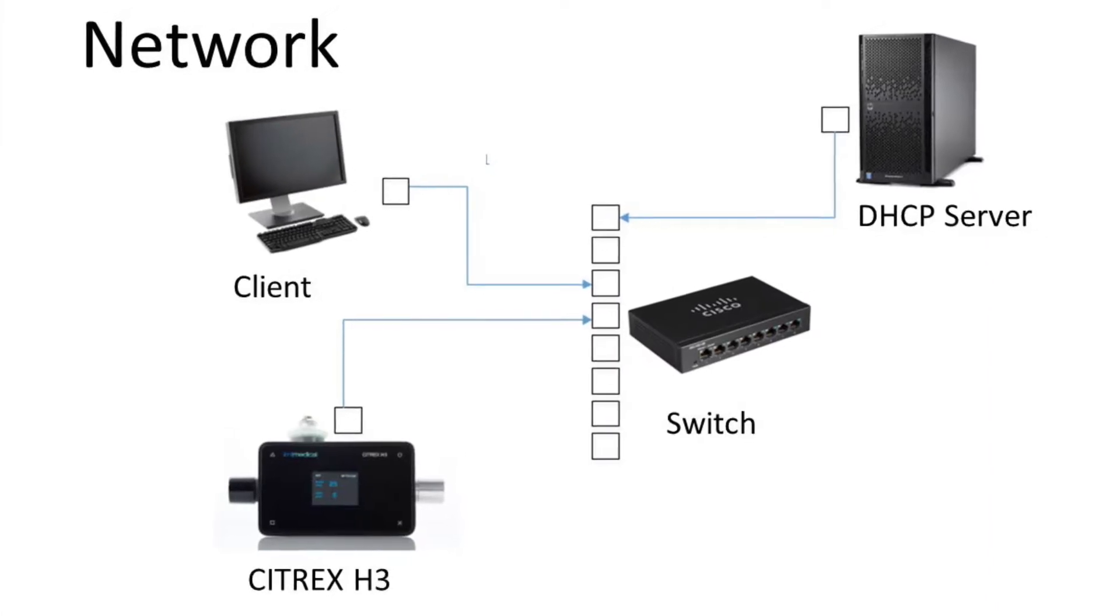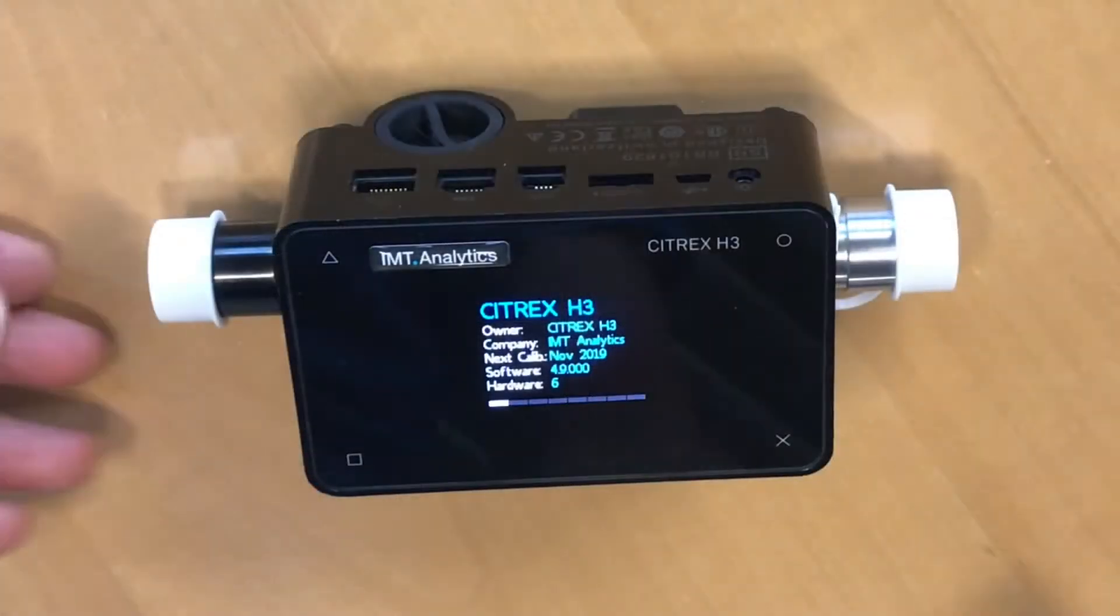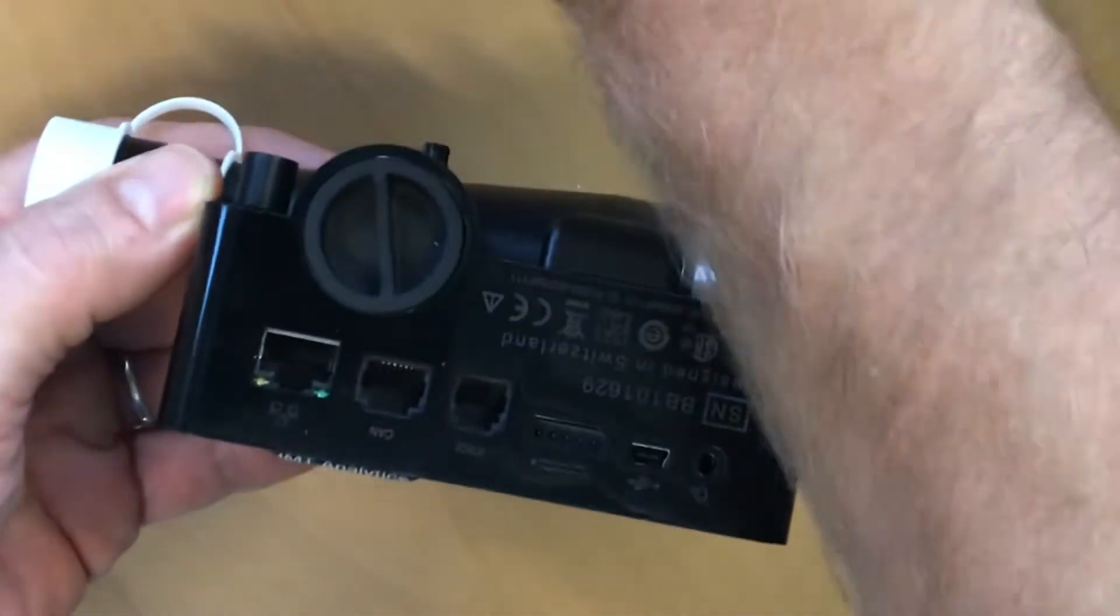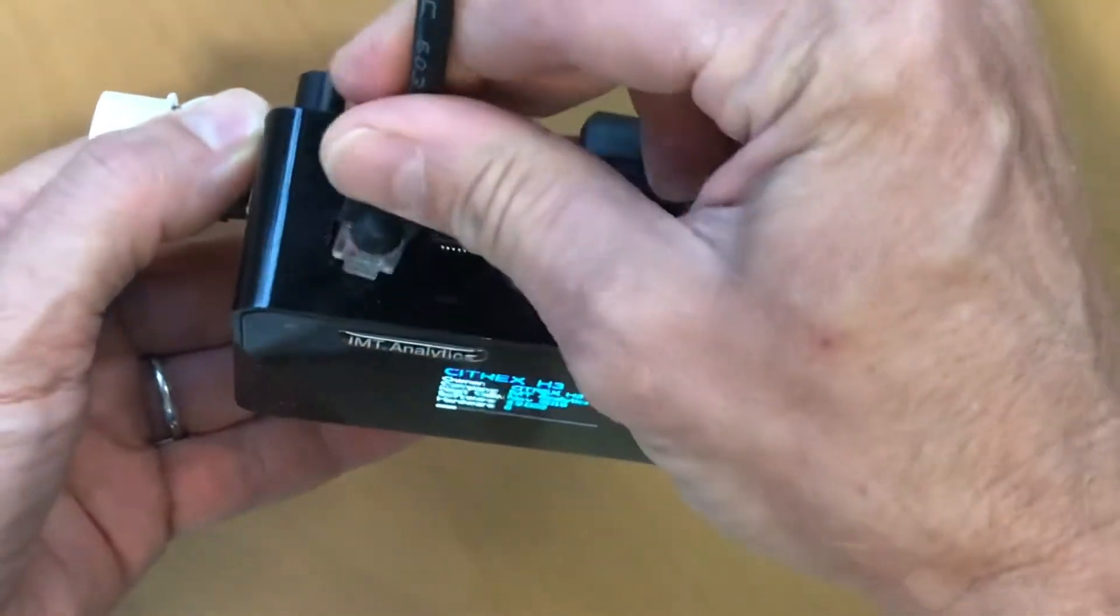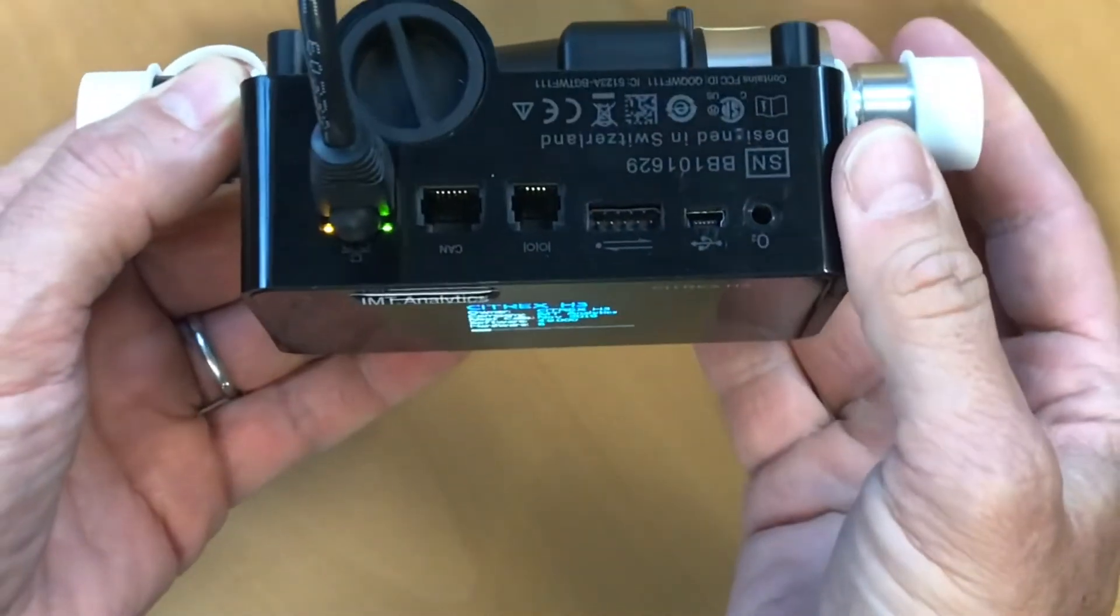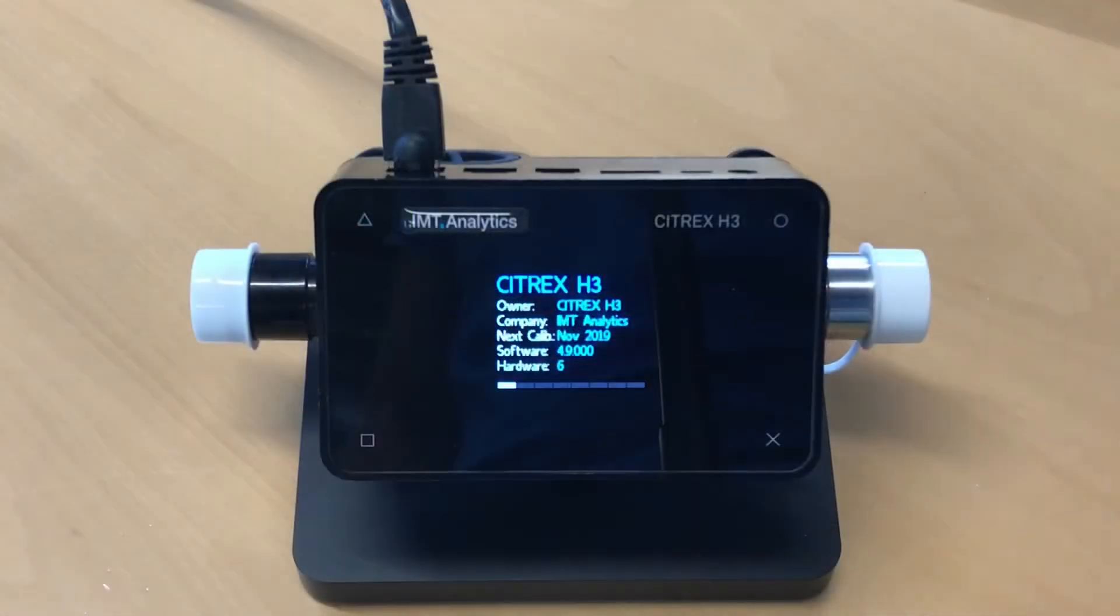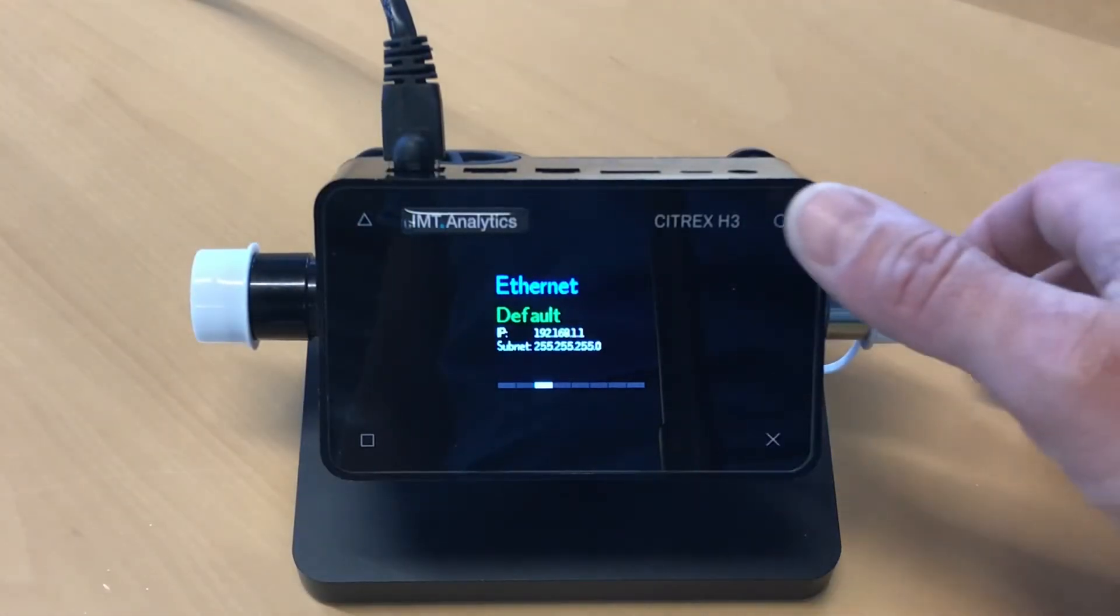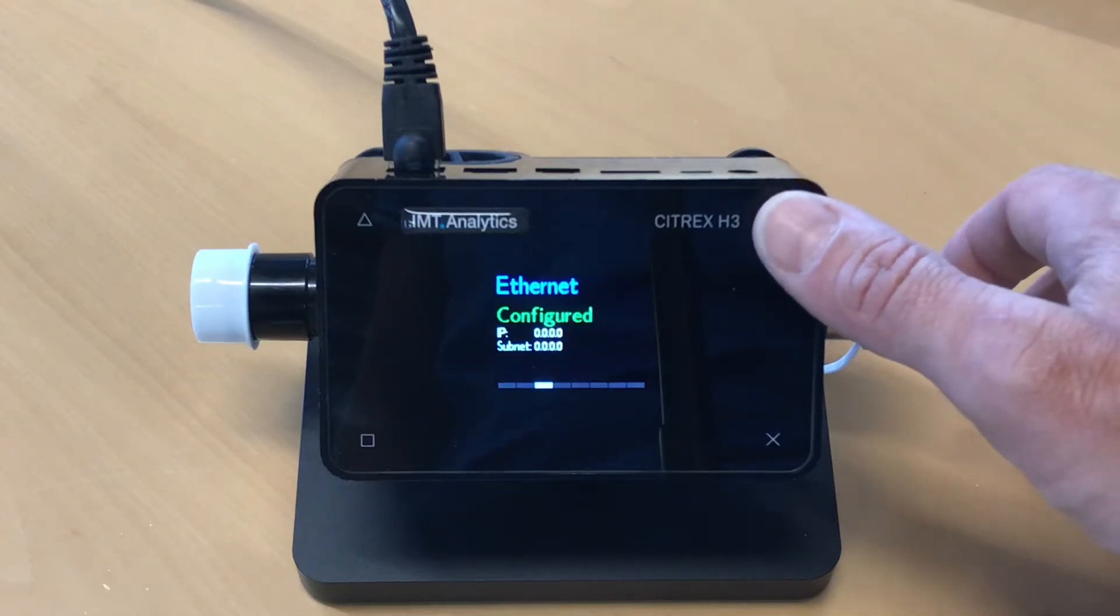In this video, I show you how to connect the Citrix H3 to your network. Just connect the ethernet cable to your Citrix device. Connection will be established. Then go to the menu on the ethernet section.